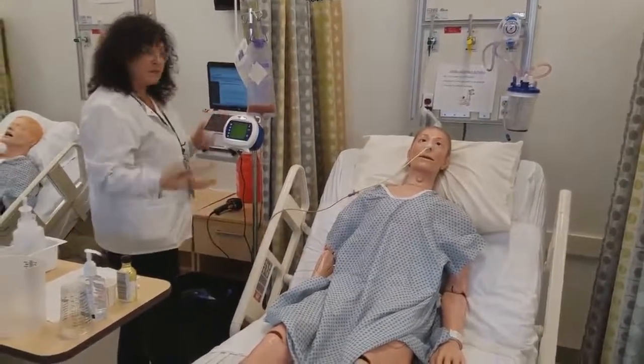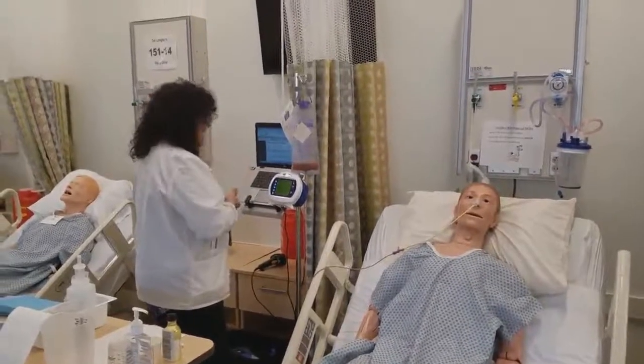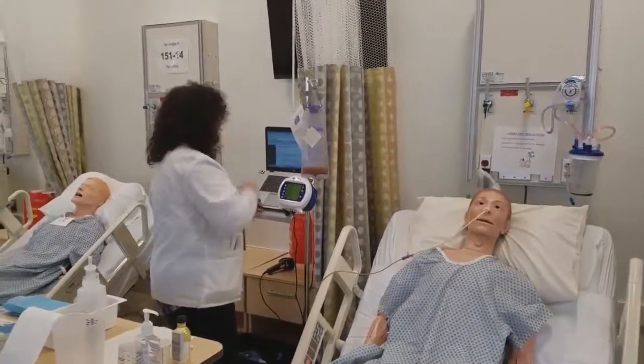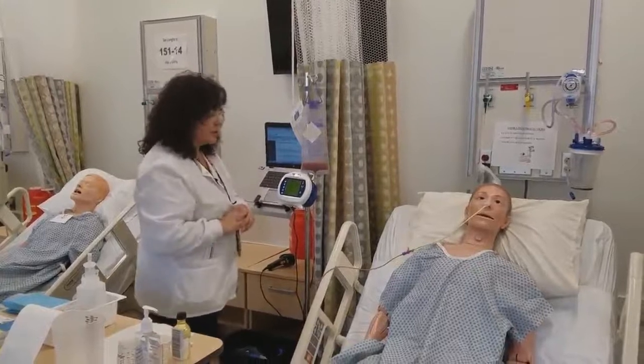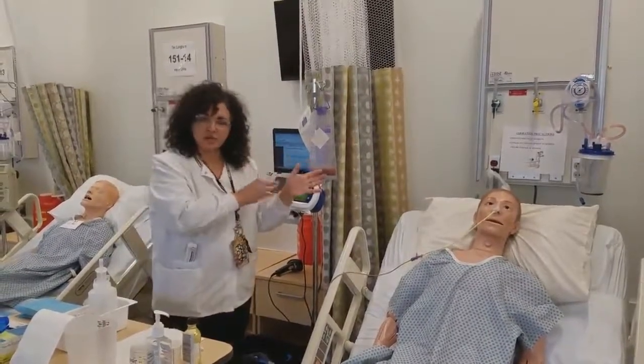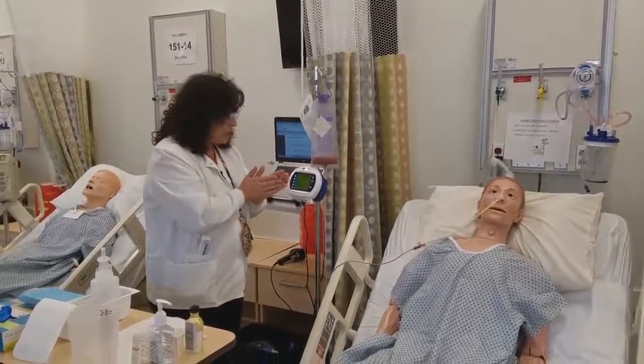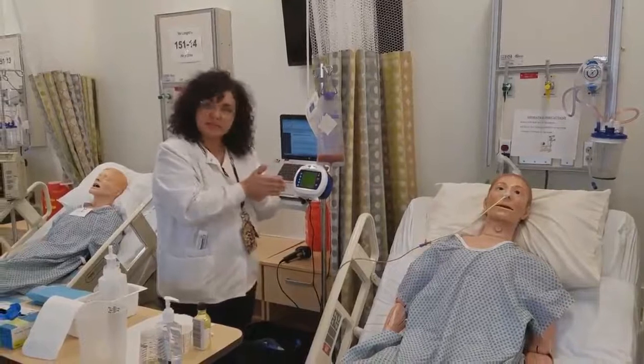Anticipating my meds, I'm going to go ahead and ask him for allergies at this point. Please confirm your allergies for me. He says I have no known allergies, and that is consistent with my chart. Okay, so first I have to check out the tube before I move forward. I am going to start by checking placement.